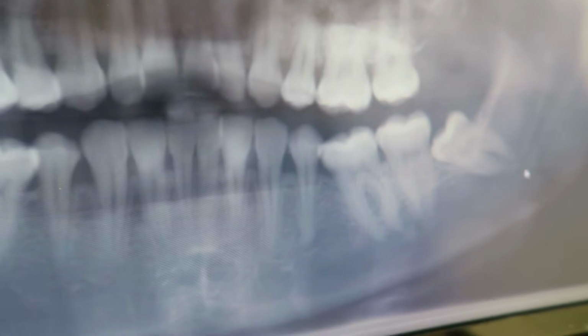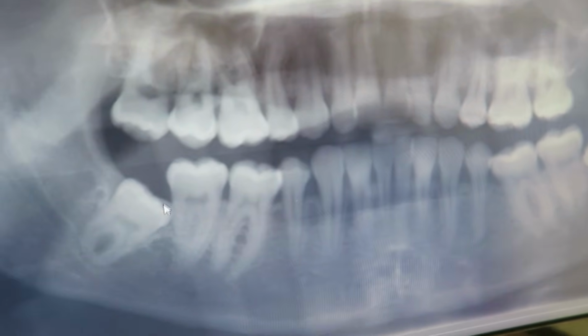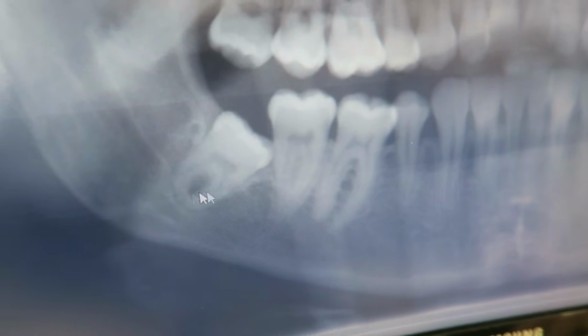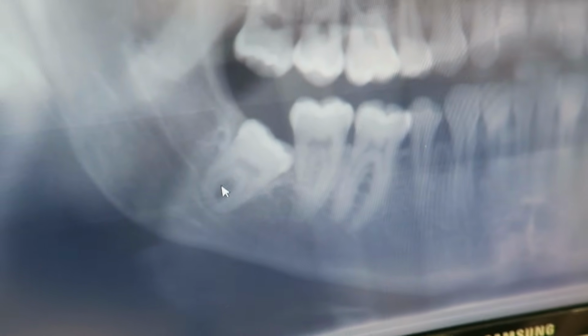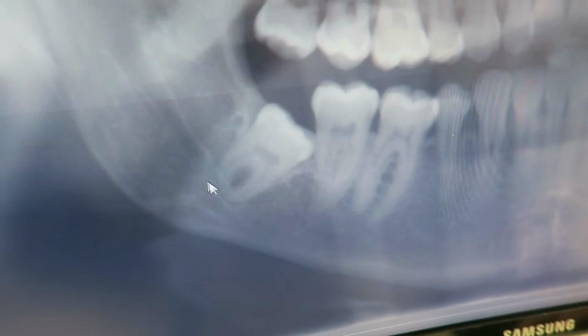So the tooth is mesioangular impacted against the 7, and if you look at the other side, it's very similar. But what you can also see here is that the roots are fused. So fused roots containing bone in between them, and again it's even closer to the ID canal.